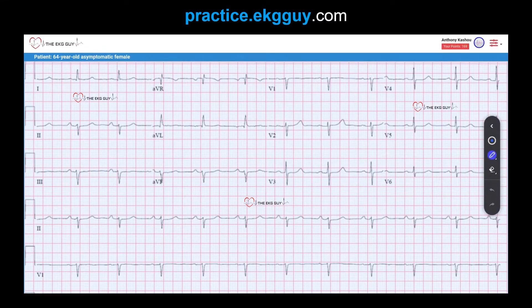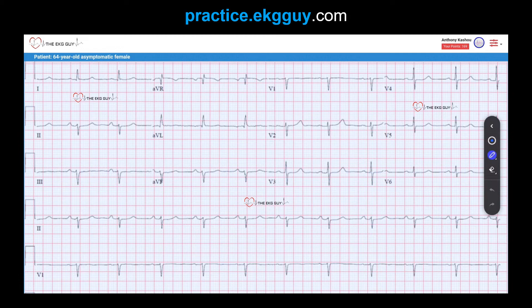Here we have an ECG obtained from a 64-year-old asymptomatic female, and there are quite a few important findings we want to take away. First, we want to determine whether sinus rhythm is present. Look at the upright P-waves we see in lead II — those clear upright P-waves down in the rhythm strip. In AVR, we see negative, inverted P-waves present as well.